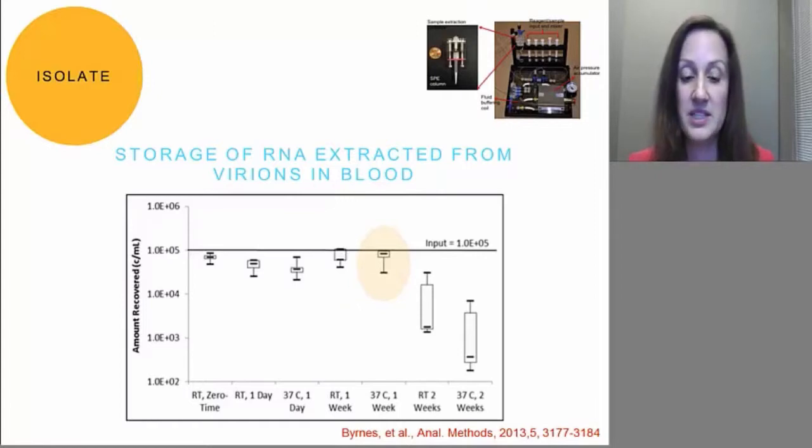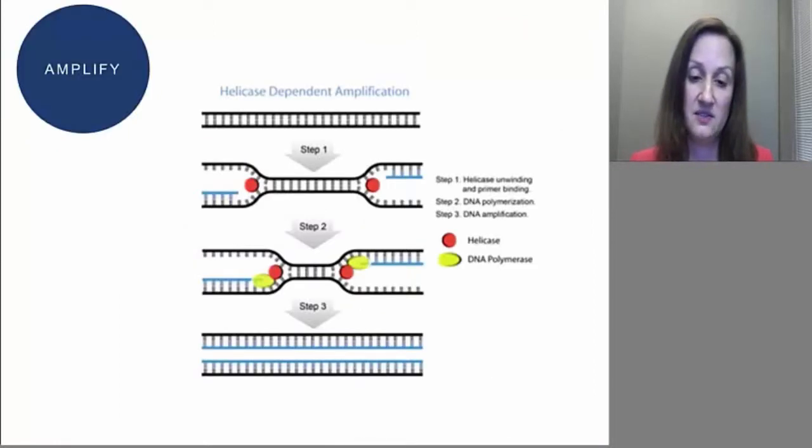This would allow people then to pick and choose what molecular assay they would like to do. It might also allow long-term storage of nucleic acid samples for surveillance activities. But of course, we would like to do amplification of the nucleic acids in the field, and how we go about that. It turns out there are a number of amplification techniques that can be performed without thermocycling, like the PCR in the influenza example at the beginning.